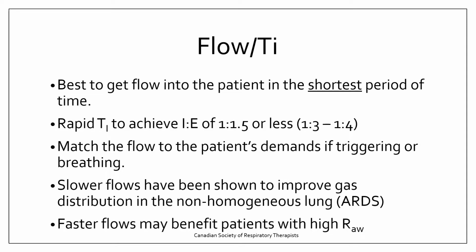So the relationship we see between flow and I time is a faster flow usually equates to a shorter I time, because flow is just a representation of volume over time, and if we want to get that volume in quicker, then we're going to need a faster flow to do that.